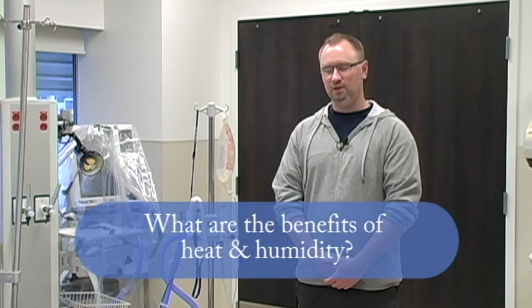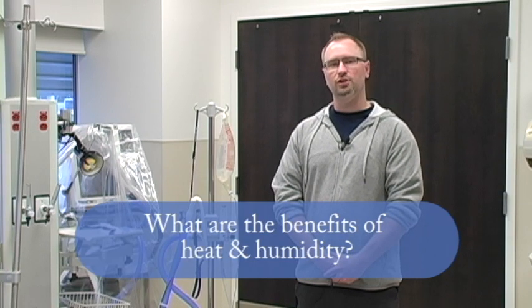What are the benefits of heating and humidifying other than patient comfort? Is the moistening of secretions. If you moisten those secretions, you improve their mobility, the ciliary clearance improves, and improves the patient cough. A good example is a pneumonia patient. They have a lot of secretions. If they're deteriorating, we'll put them on BiPAP to try to avoid intubation. The problem with that is we're strapping a mask on so they can't expectorate their secretions, and on top of that we're drying those secretions out. So something like the Optiflow would be a much better choice. It's only in the nasal prongs, they can still cough up their secretions, and with that heat and humidity it will help the ciliary work well and it'll moisten those secretions so that they can cough them out. So that's a big benefit.